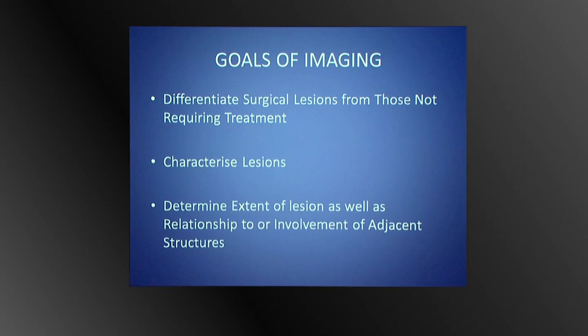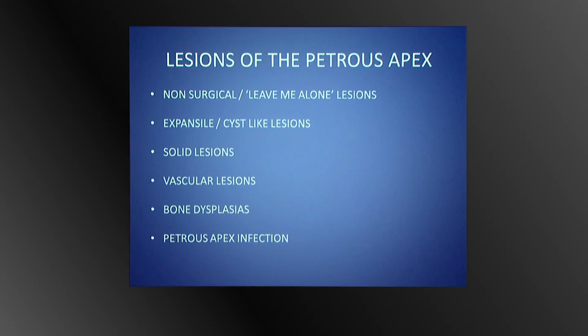And then it's always good to give the surgeons a bit more information, determine the extent of the lesion as well as its relation to involvement of those important surrounding structures.